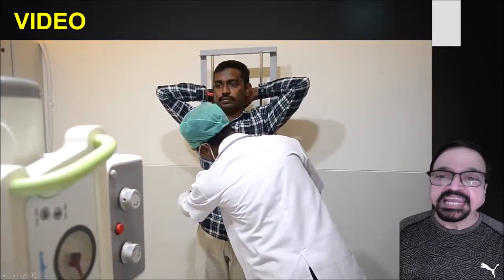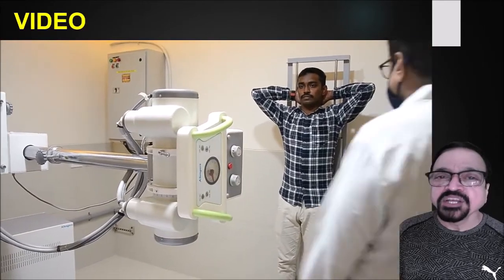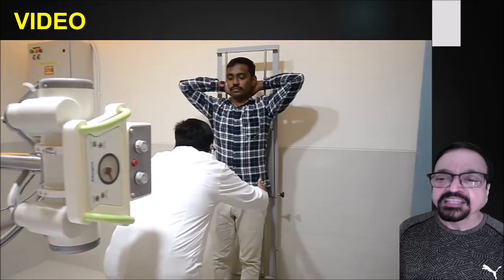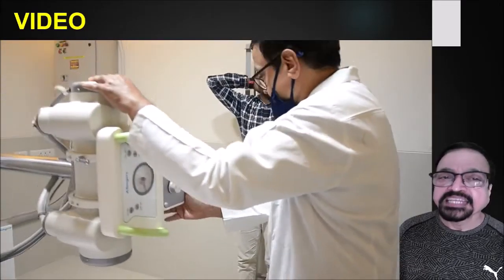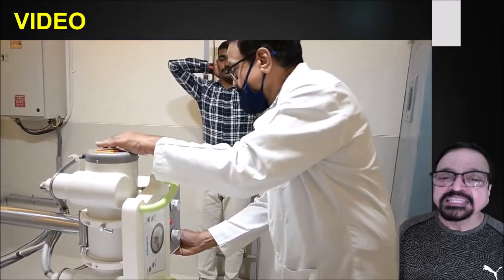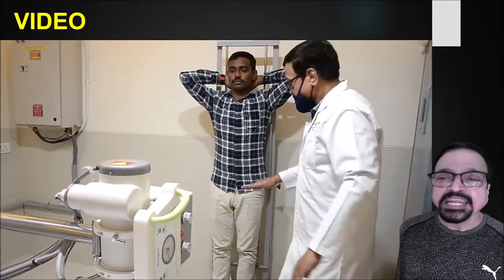Now here we are seeing how a standing radiography is done. Most lumbar patients will have nerve root compression, so it may or may not be possible for them to stand straight. However, there are certain clinical indications where we have to take a standing projection. This is for demo purposes, so the patient is standing well. Now what you have to check is that the patient is in correct AP position, number one. Second, the centering of the central ray. The central ray can be from L1 to L5 or below depending on the indication.